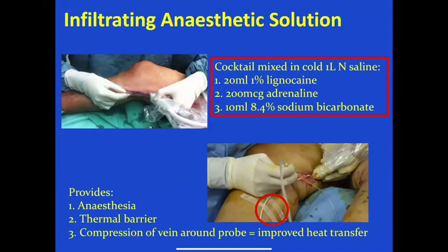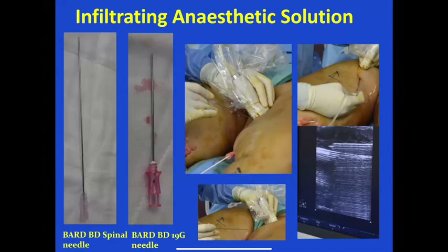What I've noticed with this endovenous microwave catheter is that it heats up quite well. And I think it's important, as I allude to, that you test it before you put it in, because you do want to make sure that it's working, even though it doesn't look as if it's working initially. That's a very key thing to start.